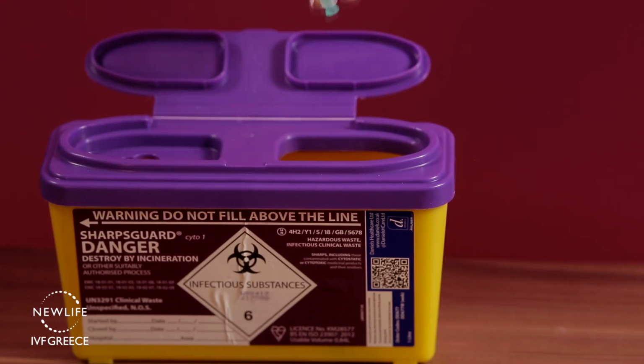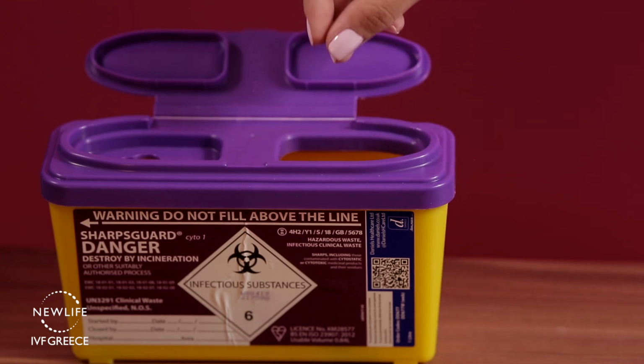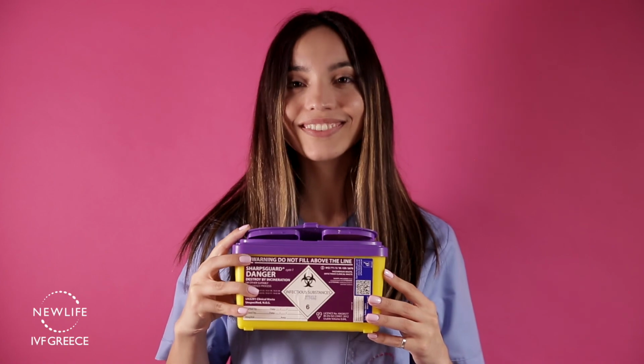Dispose the syringe along with the needles, the ampule, and the empty vial in a suitable container, or bring them to your nearest medical facility where they can be safely disposed.